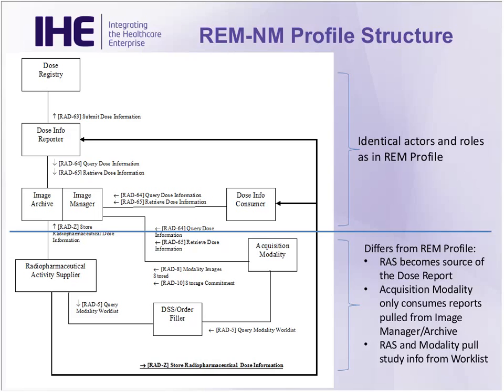So it can go and grab it from the PACS, just like the other consumers, and use that to import information that needs to be populated in the PET or nuclear medicine image objects, since those IODs require some of the same dose information. So this is how we're now automating the transfer of the information from the hot lab or the generating system over to the modalities and eliminating the paper transfer that used to go on.